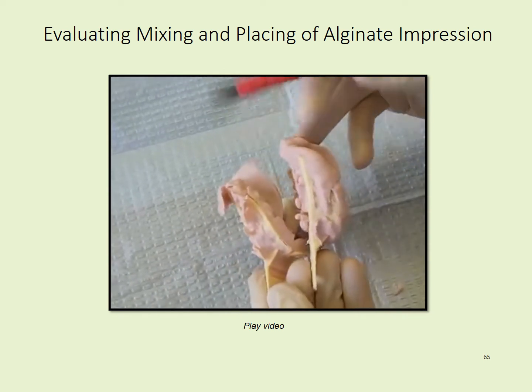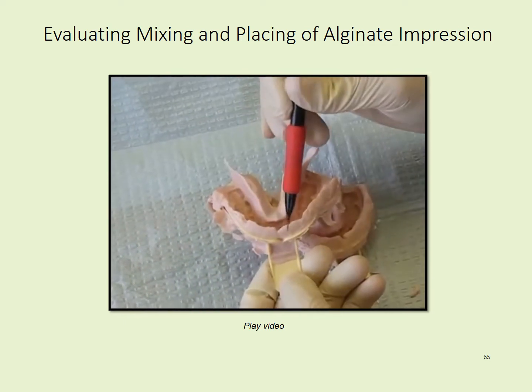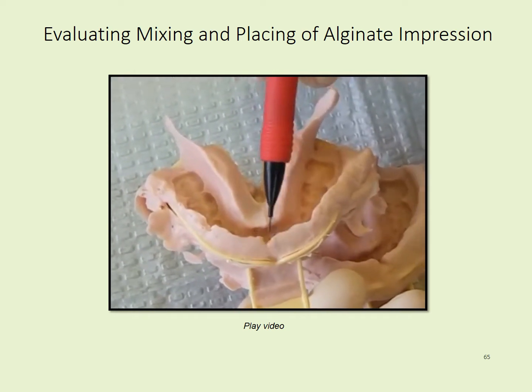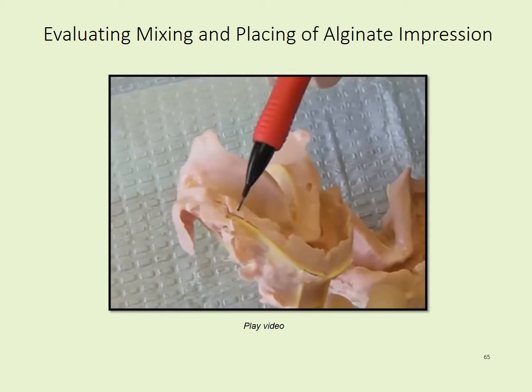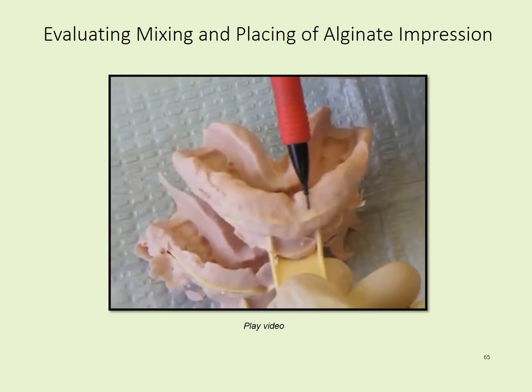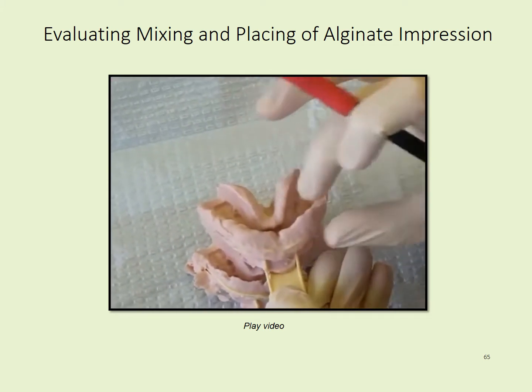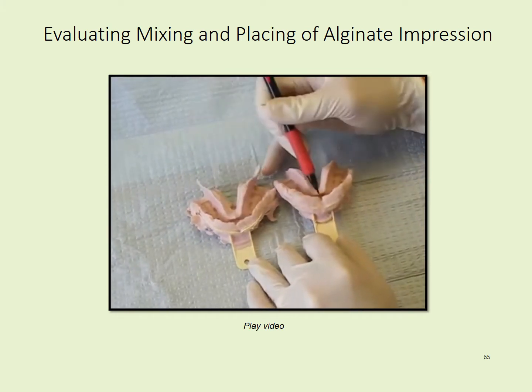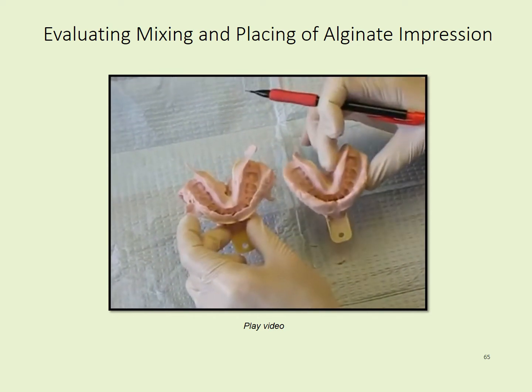And last of all is the ability, if you have a wet mix, that the material pulls away. Can you see how I can put a little bit of pressure on this and pull that front section next to that labial frenum away because the material was running? Same thing back here on the flanges of the tray. Just a little bit of pressure pulls that away, which is cause for distortion, whereas here I can apply a lot of pressure and nothing pulls away. Because the material has gone around the borders of the tray and is stiff and holding to itself, you don't get that flimsy reaction like you do here. Okay? So those are comparing one that was flimsy and one that was not.